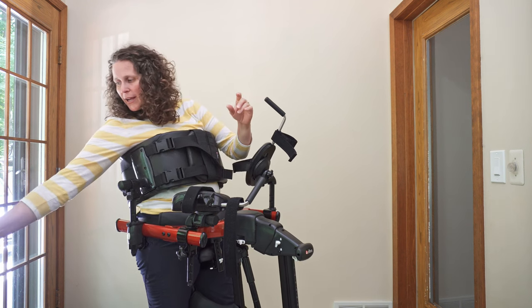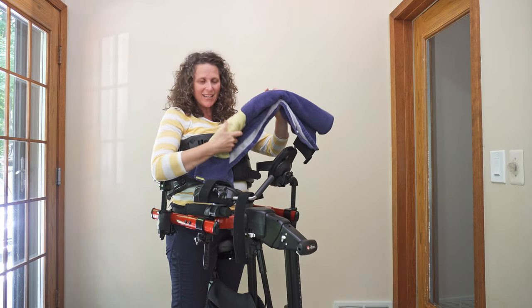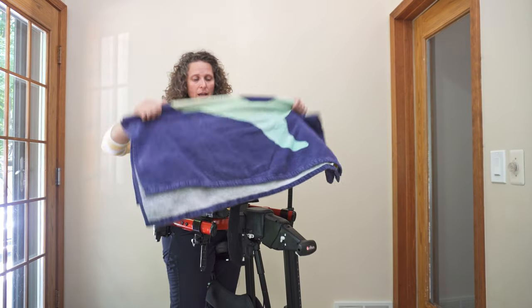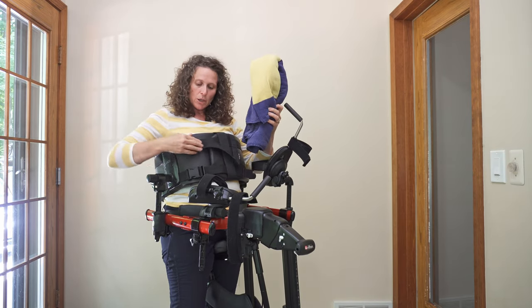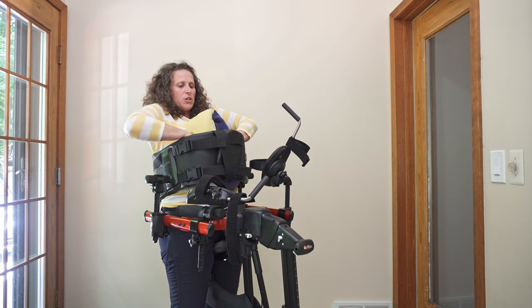One other thing you may want to try is this rainbow technique. What I do is take a towel, fold it in half, roll it up, and make a rainbow with it. Then I'm going to loosen up my chest prompt and push it right in the front of the trunk.